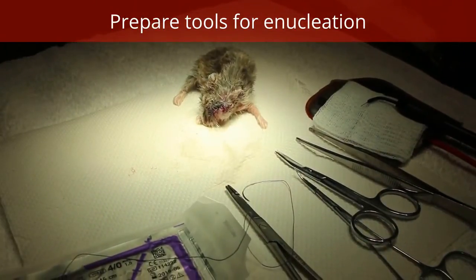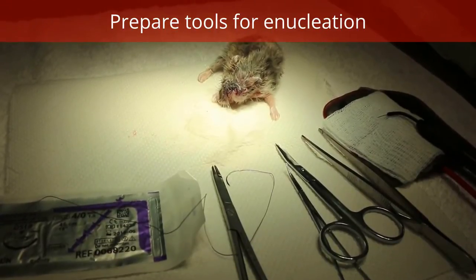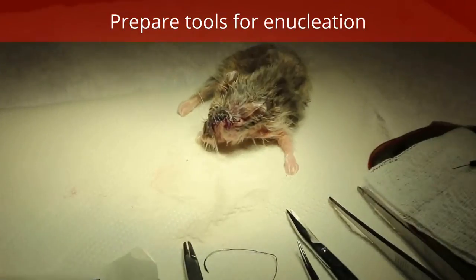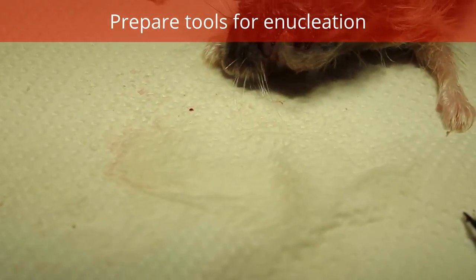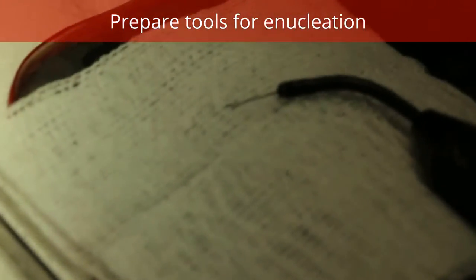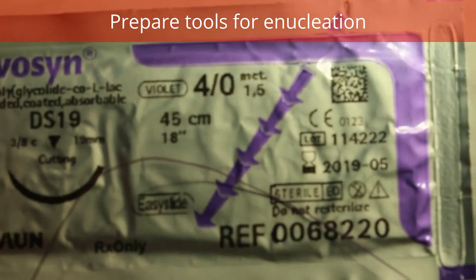In conclusion, enucleation of the dwarf hamster is similar to the dog in that you excise the margin of the eyelid, about 2 millimeters, then you exteriorize the eyeball. As in the dog, you clamp the optic stalk, but of course it's hard to see in the hamster. The electro incision saves a lot of time and is easier, and electrocoagulation handles the bleeding. After taking out the eyeball, you stitch up the upper and lower eyelid margins with 4-0 absorbable suture. In this case, we use Novosyn, but you can use any absorbable suture.